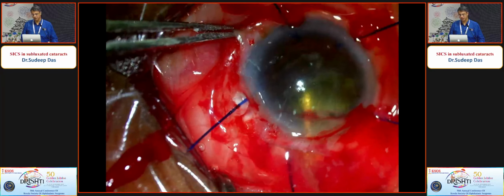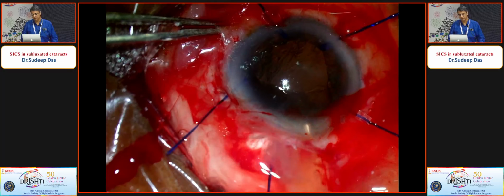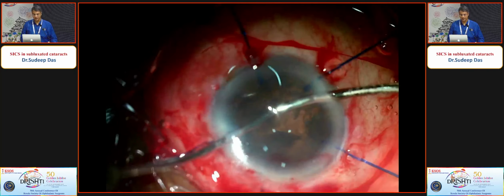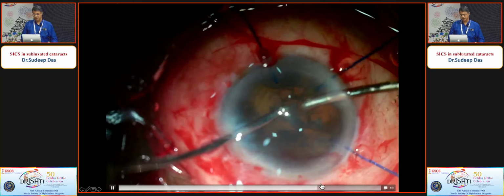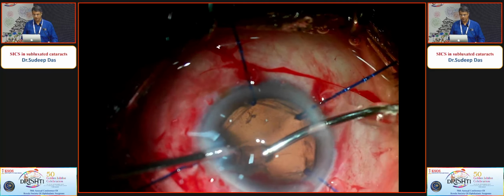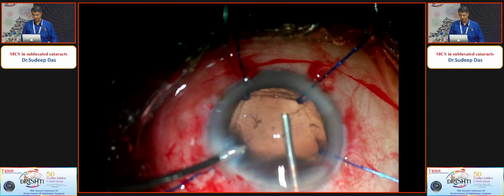So this was, like I said, not a very hard cataract. I could actually remove it with viscoelastic itself. But if it's much harder than this, then yes, use sandwich or whatever. No reason that you can't use Simcoe through one of the side ports, but I don't use a Simcoe ever in my life. I use a bimanual for everything.